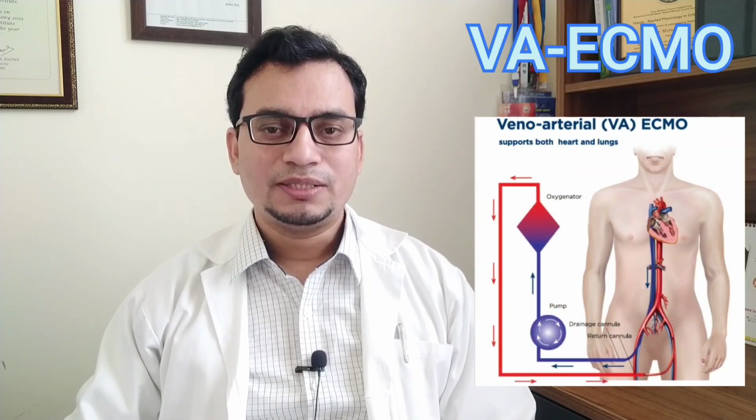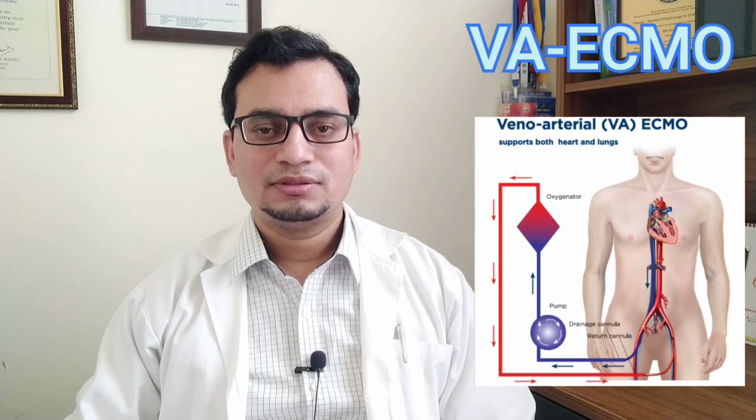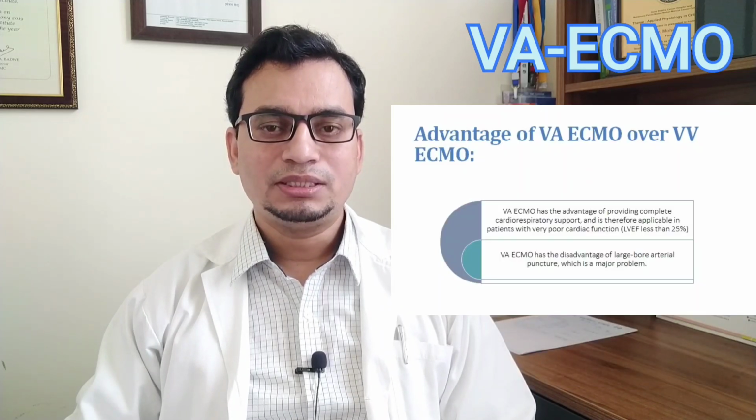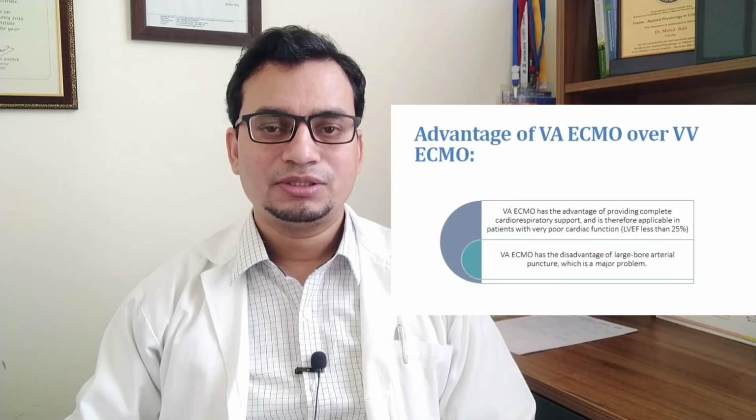During VA ECMO, blood is extracted from the right atrium and returned to the arterial system, bypassing the heart and lungs. The VA ECMO provides both respiratory and hemodynamic support, like a bypass. VA ECMO has the advantage of providing complete cardiorespiratory support and is therefore applicable in patients with very poor cardiac reserve, with a left ventricular ejection fraction less than 25%.